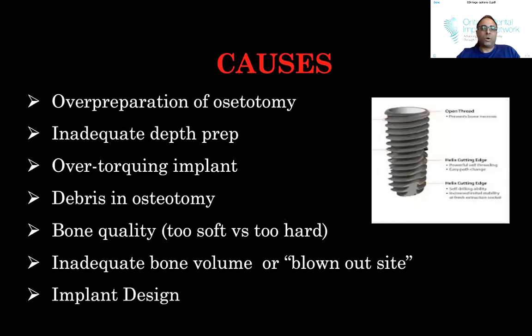Okay, so it's important not to stay in that site too long. Inadequate depth. If you over prepare, that's a problem because that will lead to your implant being loose or not stable. Inadequate depth. So you're trying to place your implant, but now you're over torquing it. You just keep torquing it in, but the implant's not going to cut apically, especially in the lower, right? In the upper, you might have some soft bone, you might be able to push things up. So it's important to not over torque, to prep your depth properly.